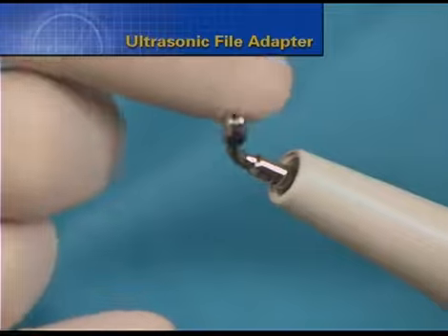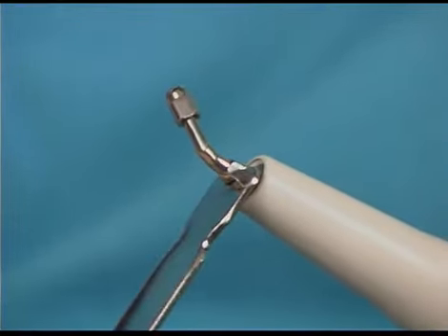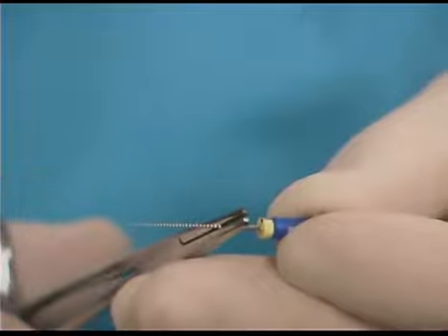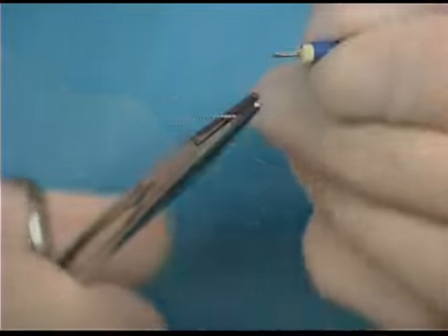Sometimes ultrasonic trephining procedures are unsuccessful due to a lack of vision or anatomical restrictions. In these instances, the handle from a stainless steel hand file can be intentionally removed and the shaft of the instrument inserted into a device called the file adapter.